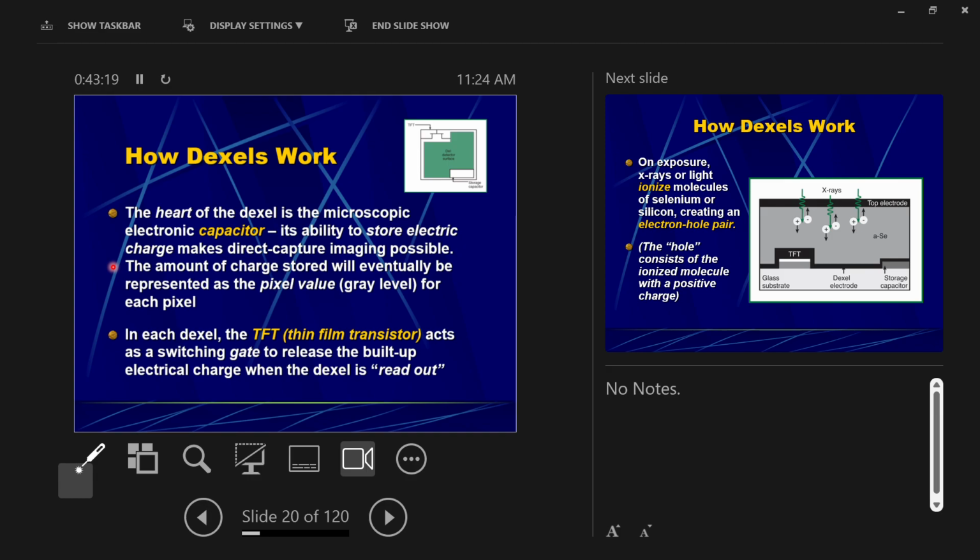That's why digital has these advantages. You could never invert a film x-ray, right? You can only hot light it or magnify it with a literal magnifying glass, right? We've got a bunch of other things we can do now that are hugely useful.